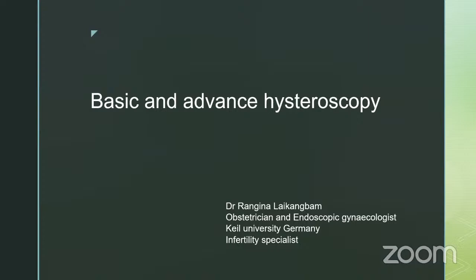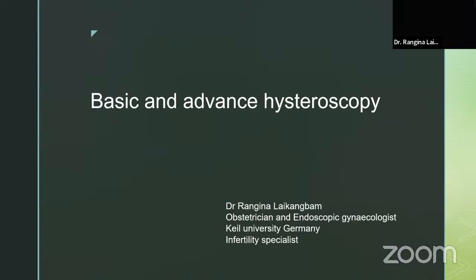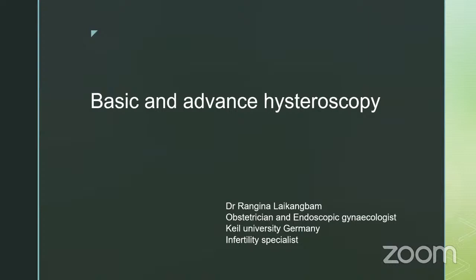And one more question is: if a patient has previous CS 1 or 2 with AUB, can hysteroscopy be a good option? Yes, why not? We can reduce the pressure and the flow. Even if the patient has a previous uterine perforation history or two previous cesarean sections with AUB, we can reduce the pressure and the flow, and of course we can do a hysteroscopy for the patient. Very true, totally agreed.